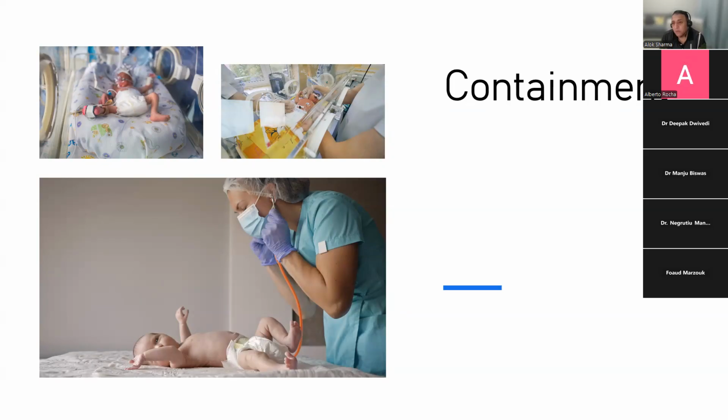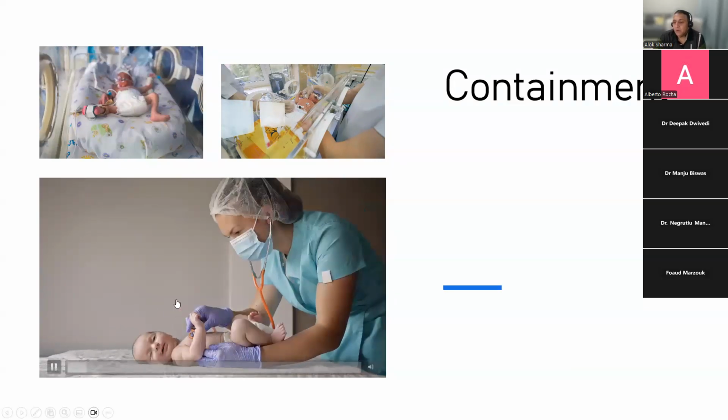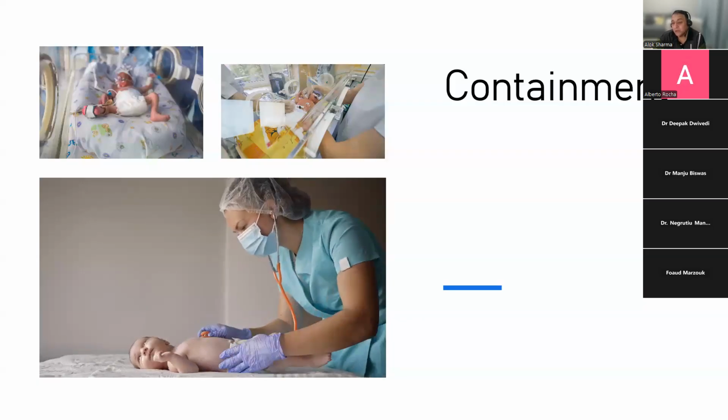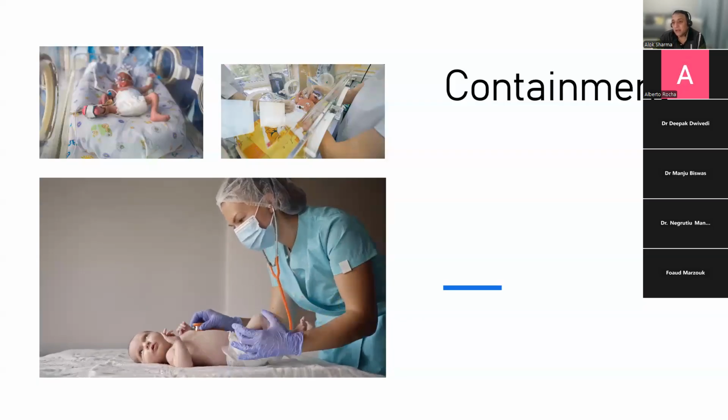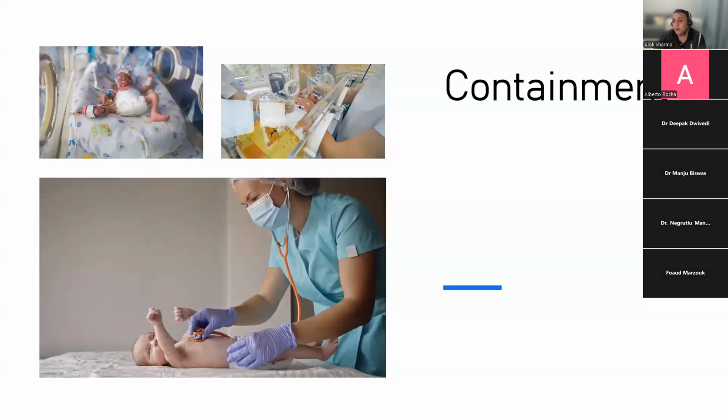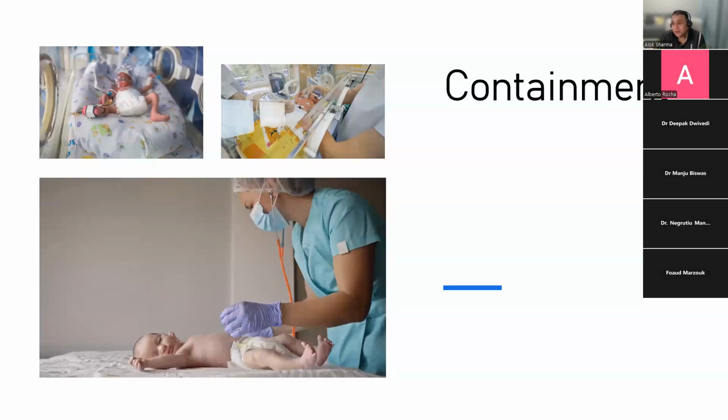That's the way we work in our unit. They may want me to do a scan for a particular indication. From my perspective, if it's an extremely preterm baby who they might not have seen that morning, and his blood pressure is in his boots and he's on 3 inotropes and his hemoglobin has dropped to 8, that's an urgent scan. That's a limited scan that needs to tell me whether he's got an IVH or not. It is not an enhanced scan.